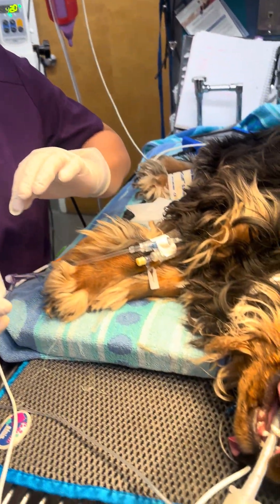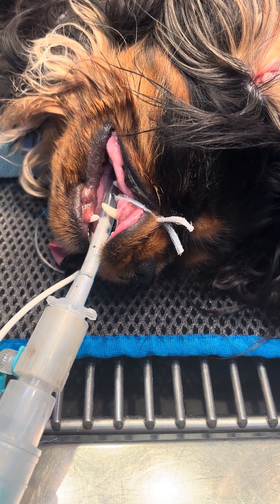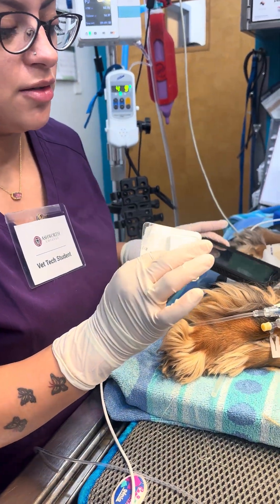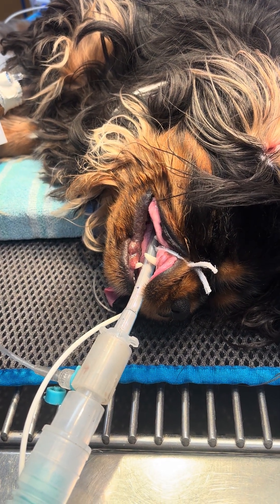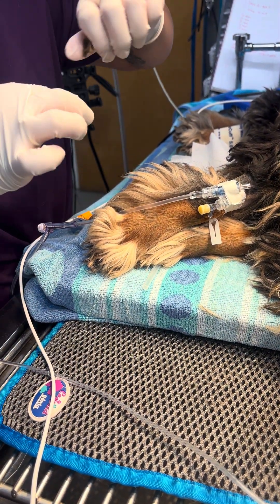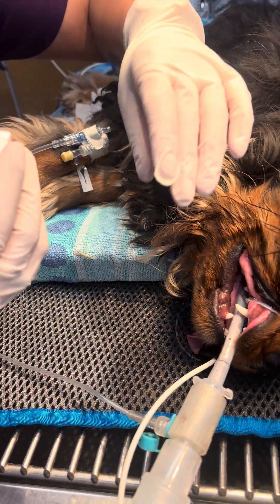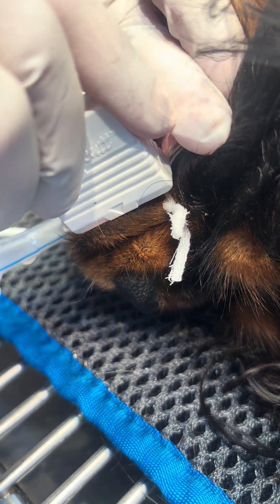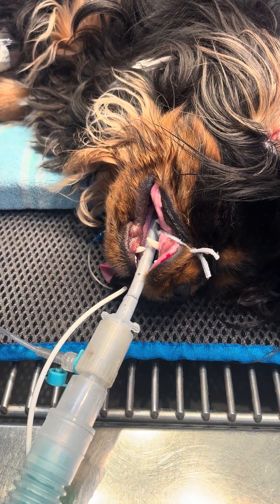In this video we're going to be doing the buccal mucosal bleeding time. We have our lancet, a couple of tissues that we're going to use for blotting, and a phone that we're going to set for five minutes while we're checking the bleeding time. I'm going to line this up right around here. Perfect — now we're going to set our timer.